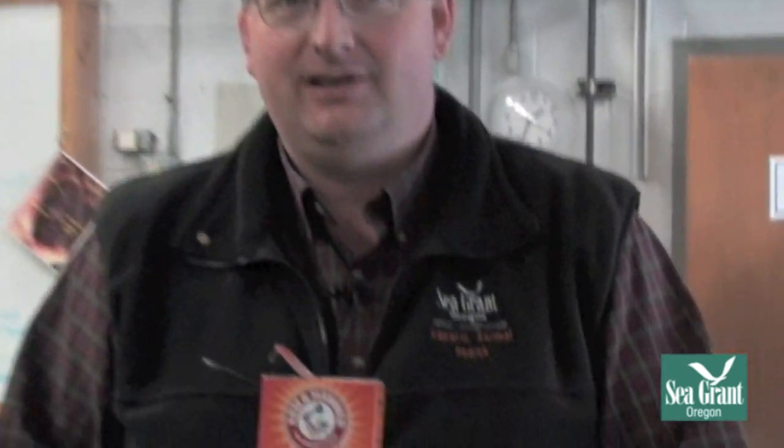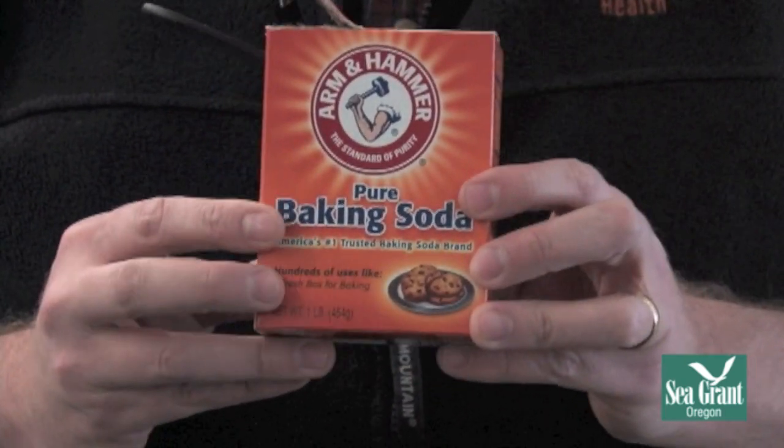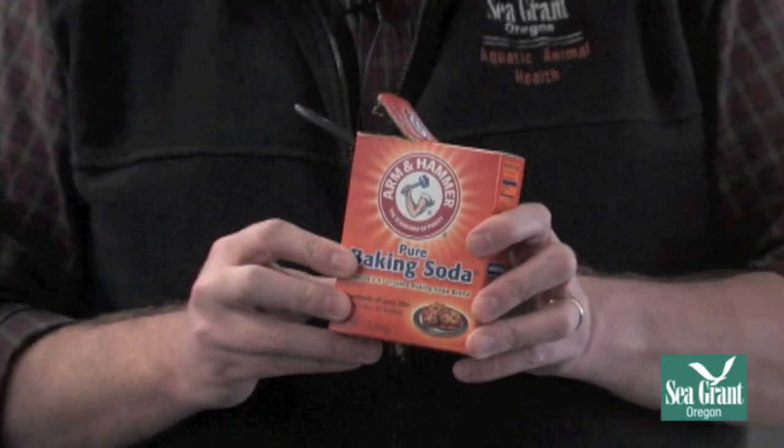Typically what we do is use Arm & Hammer baking soda. If you're squeamish about using something that isn't pharmaceutical grade, you can go buy pharmaceutical grade sodium bicarbonate, but baking soda is a buck a box, so this is what we use. The amount we use is double the amount calculated for the MS-222. For instance, if I need three grams of MS-222, I would add six grams of baking soda.